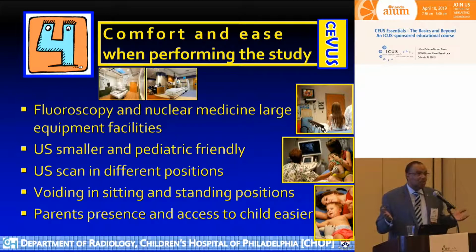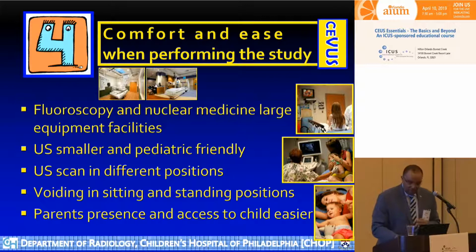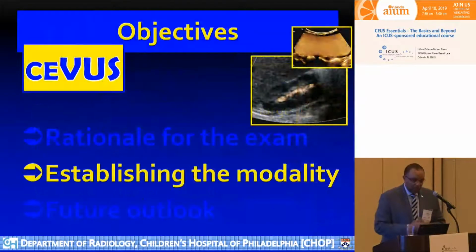It's very hard to do these in a fluoroscopy machine if you try it. It's just cumbersome. You can't do these things. So it's very comfortable to be able to do it in such a physiological way. That's why this is very helpful, and the parents really like it because they hold the child. The child can be hugging the parents and crying while you scan from the back, you know? So these are important things not to forget.